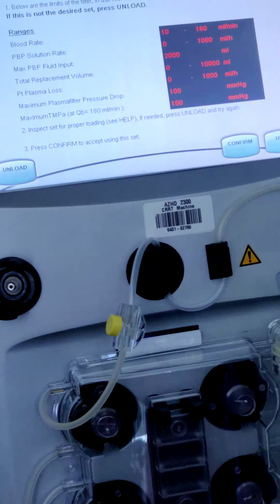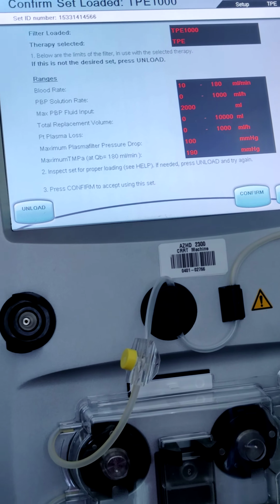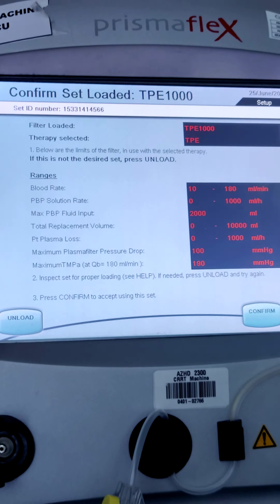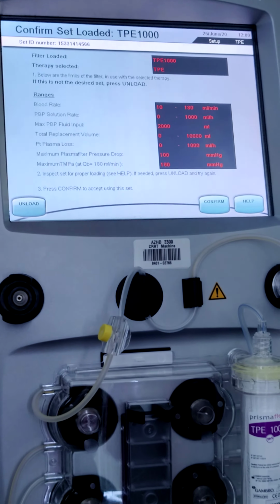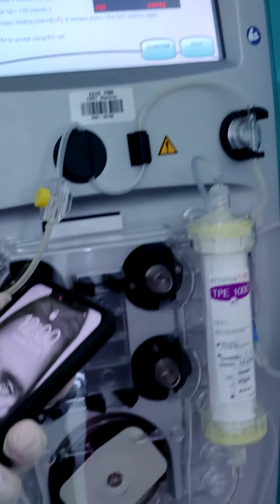2.7. We can just think how long we need to remove this 2.7. Let's say, for a small patient like 60 kg, 2.5 hours. We can calculate on this and check the rate. Calculate the rate. Okay, and 2.5 means, divided 2,700.